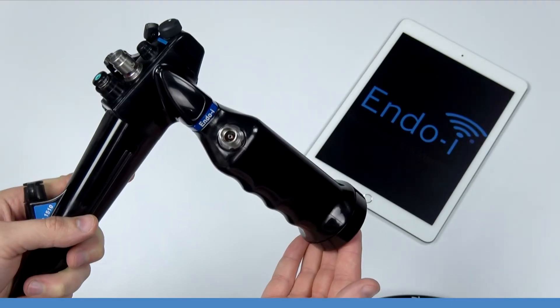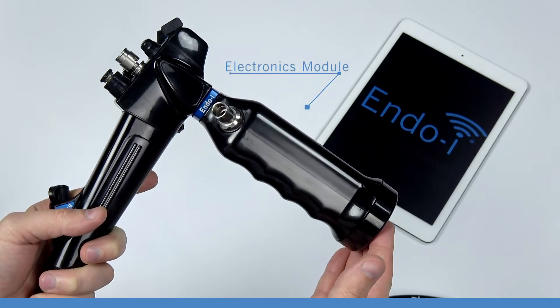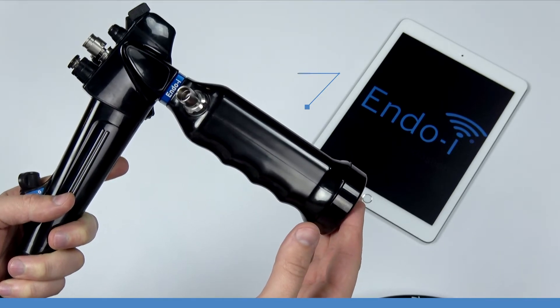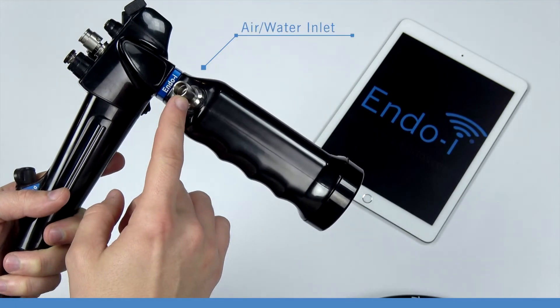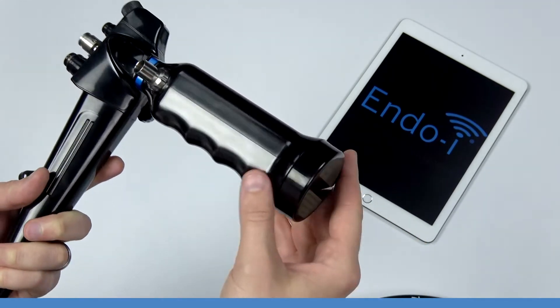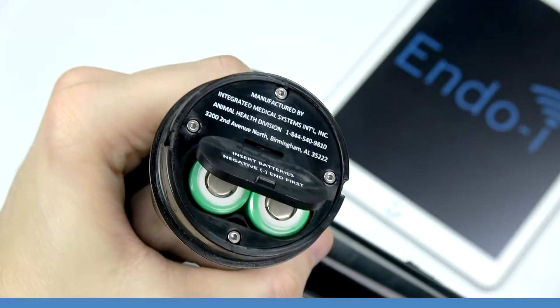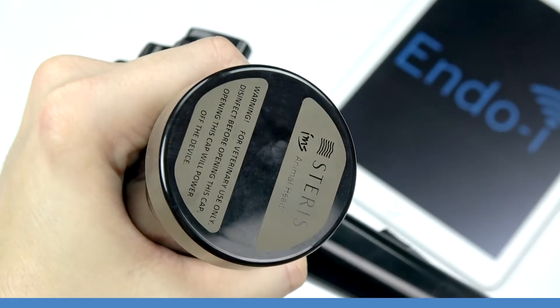A unique feature of the EndoEye is the electronics module, which enables each EndoEye to transmit the procedural image wirelessly to a smart device using its own Wi-Fi signal. On the electronics module, we also have the air water inlet where you can connect the optional lens washing system, and the battery cover. The battery cover cap acts as a compression fit — place both batteries negative side down and simply screw the battery cover cap back on.